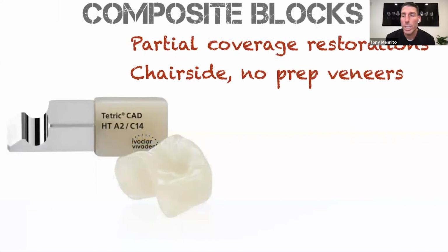All right, let's switch gears and talk about composite blocks. This is a different type of material now. These are sometimes called hybrids because some of these materials have a little bit of zirconia or silica in them. So they're considered technically a ceramic or a nano ceramic. I like these materials for only a few indications. One would be an onlay. I do these for onlays.